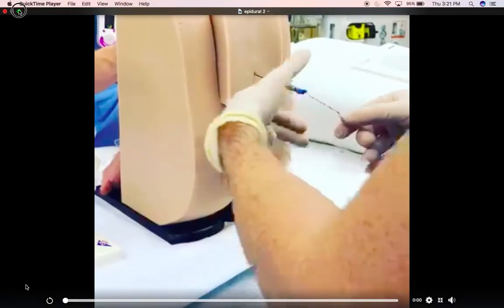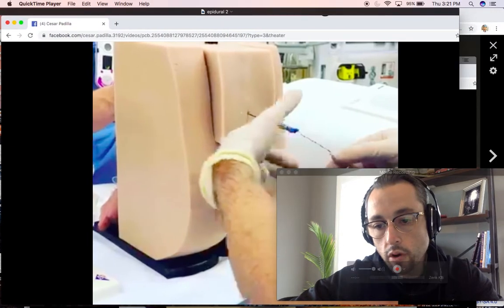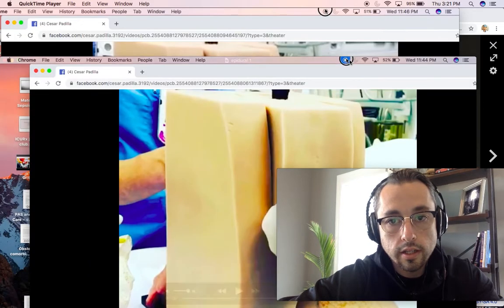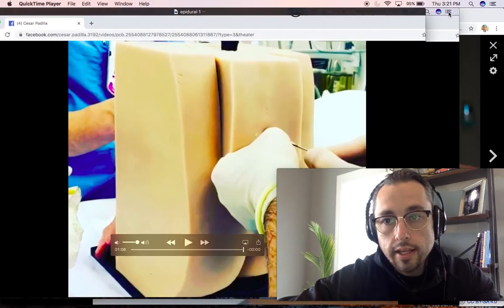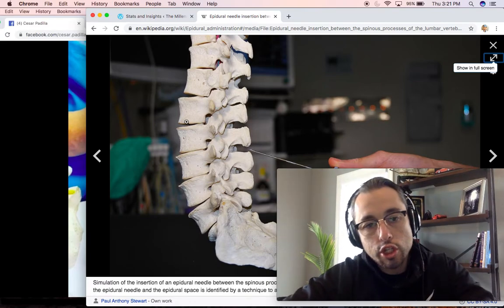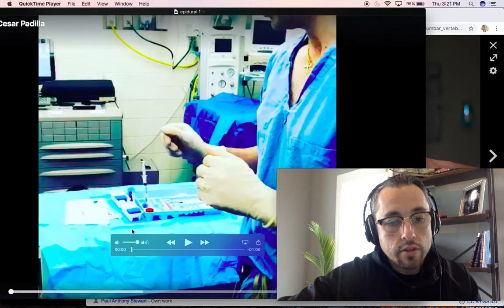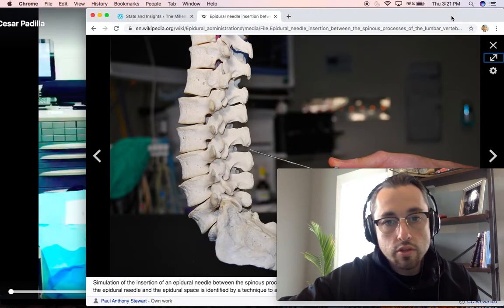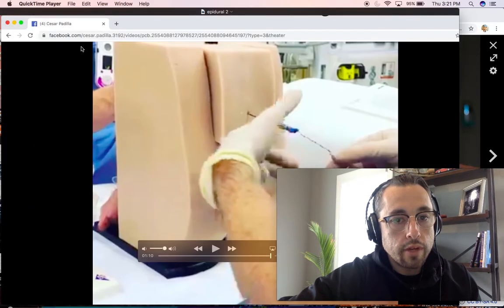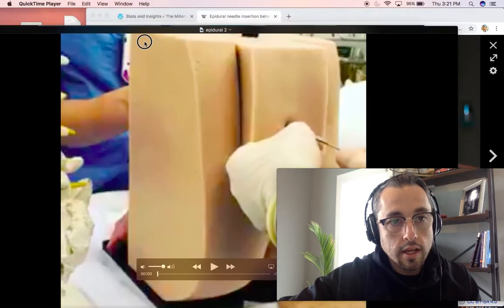All right, so that's the straightforward approach to placing an epidural. But again, if you've seen other educational videos that I've made, it doesn't really mean much if there's not an explanation behind it. So what I'm going to do is take you step by step so you really have a comprehensive understanding of the epidural technique.